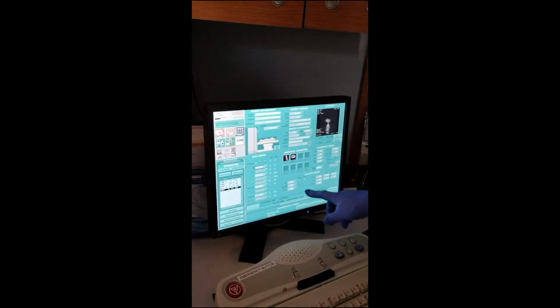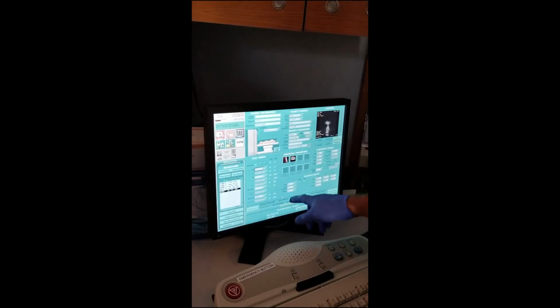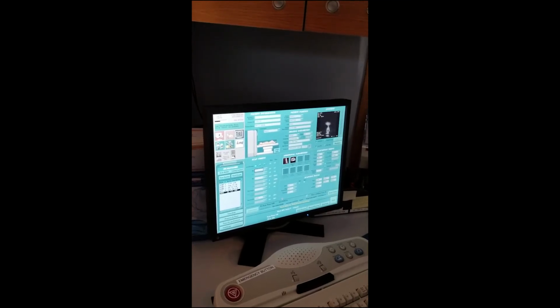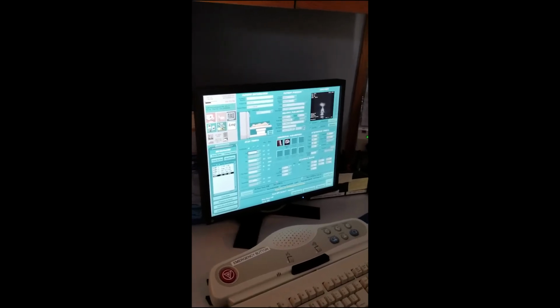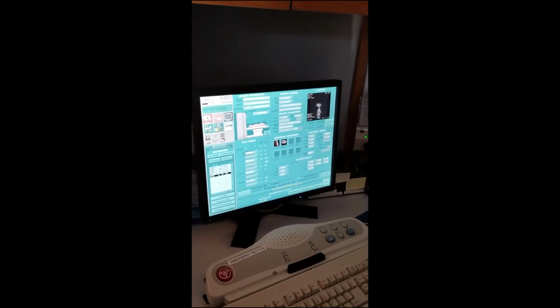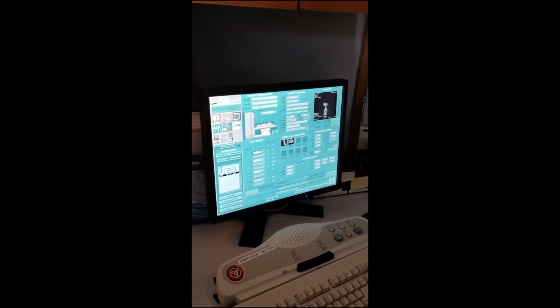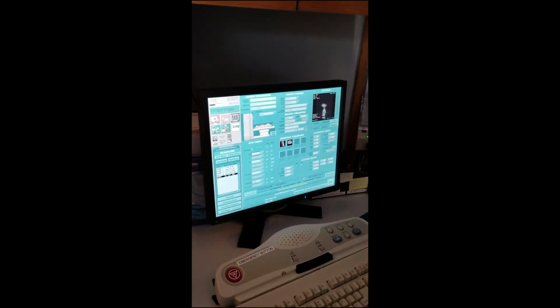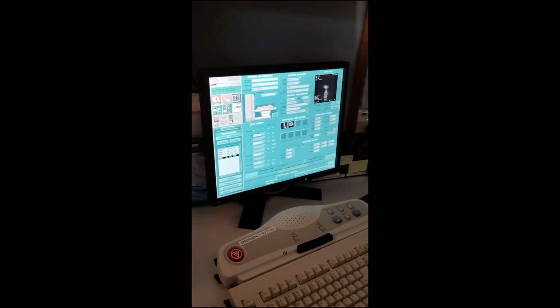So these three on T2 and gradient have to match: field of view, slice thickness, and spacing. If one of them does not match, you cannot copy paste. Just like you cannot copy this if you want this to be blue, because it's red. You can't make it blue. You understand? Those three parameters have to match, not these. These don't matter. These three parameters must match in order to copy paste.